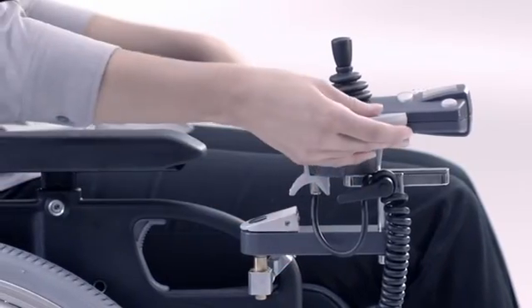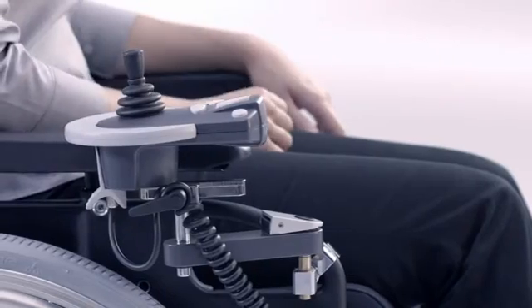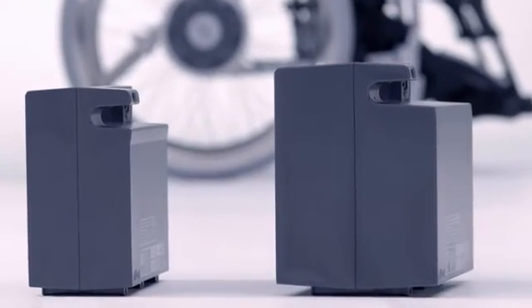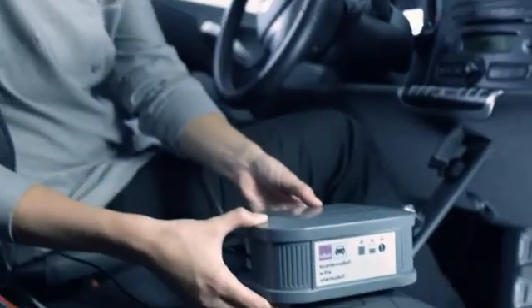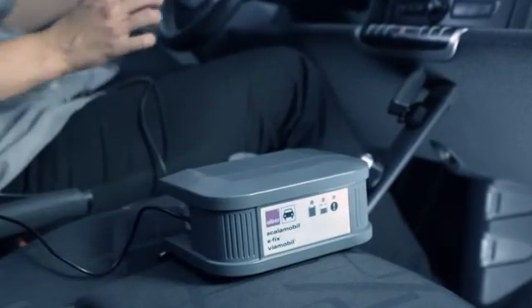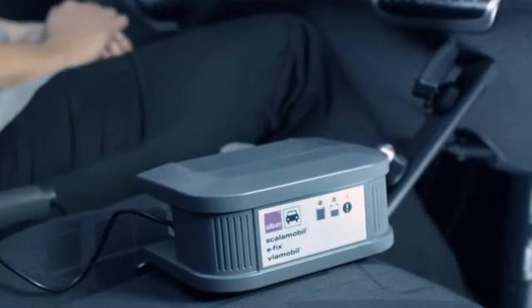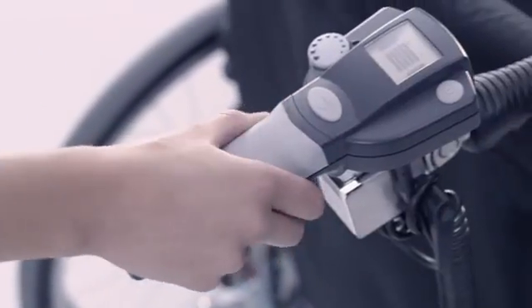A comprehensive range of accessories is available for eFix. For example, a swiveling arm, allowing you to move close up to tables. A larger battery pack for ranges up to 30km. A recharger for charging eFix batteries in your car. And a control for your carer, plus lots more.